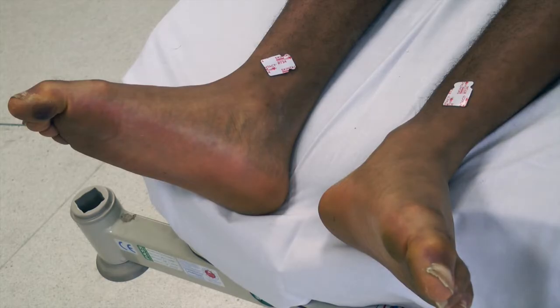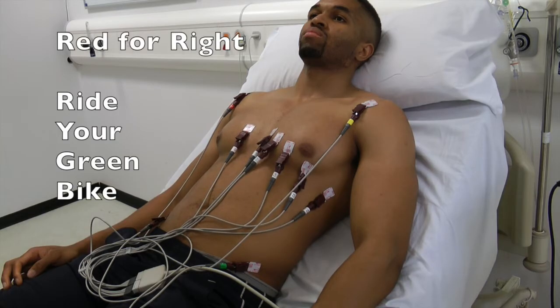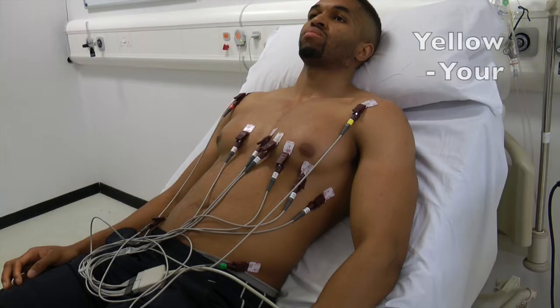You may wish to attach the limb leads to the shoulders and to the hips as shown here. An aide-mémoire is to remember 'ride your green bike', starting with the right shoulder and moving clockwise: red, yellow, green, black.